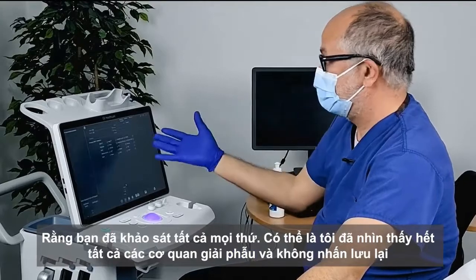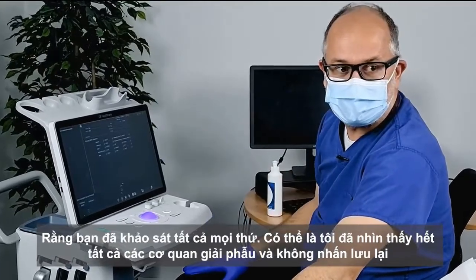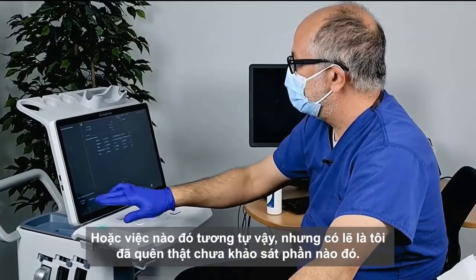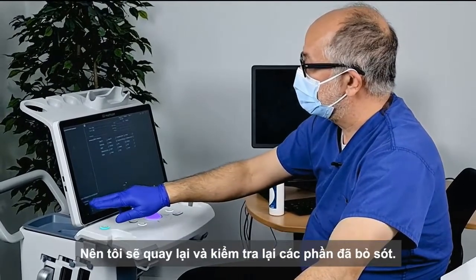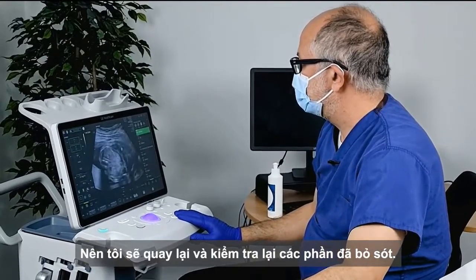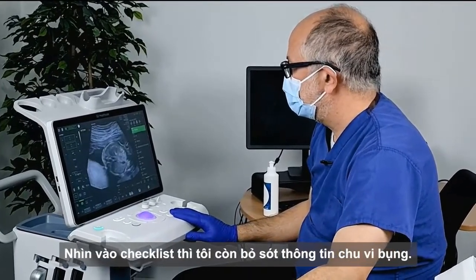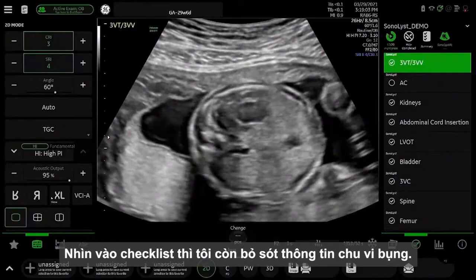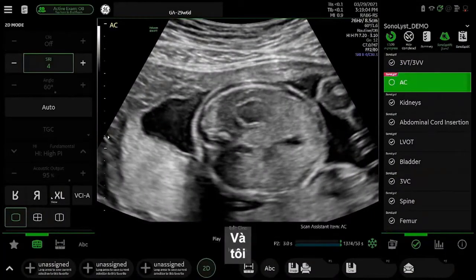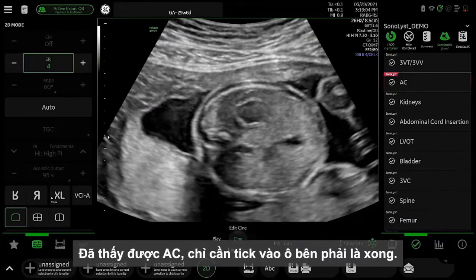And it may be that I've seen it and not pressed save or something like that, which is fine. But perhaps I've forgotten it, and then what I can do is just continue the exam in order to get those last few things. So one of them was the abdominal circumference here. So this is the abdominal circumference. And I click yes, I've seen it.